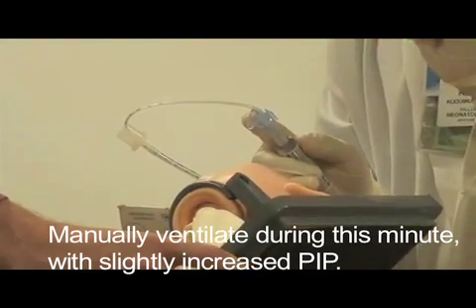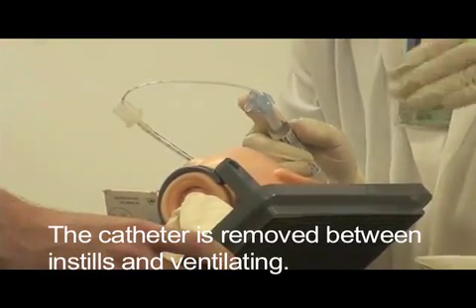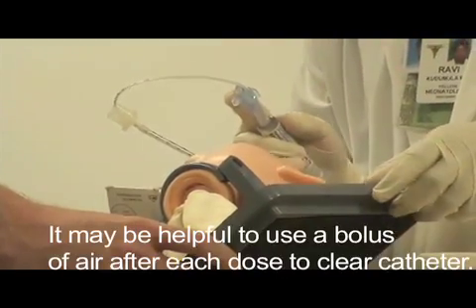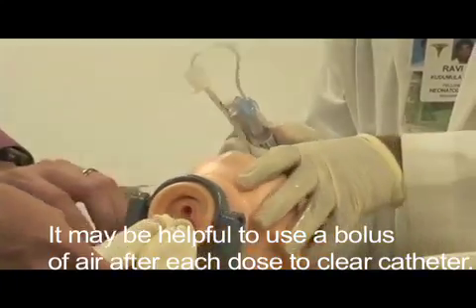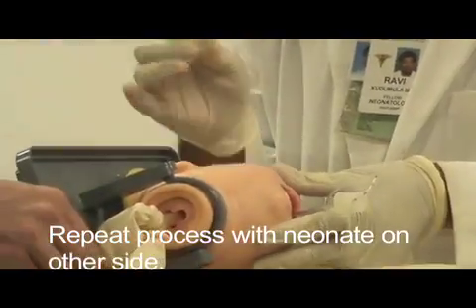If I'm lagging, I'll increase a little bit more PIP. Otherwise, if I'm using a ventilator, I'll go up on the settings and reset. We time it for one minute, then turn to the other side and keep it one minute again.